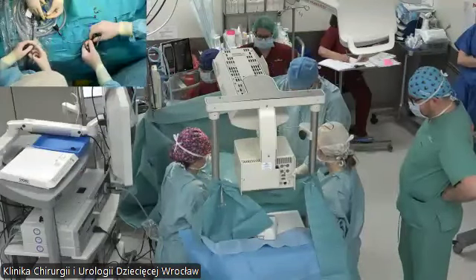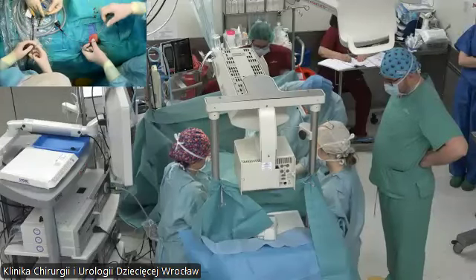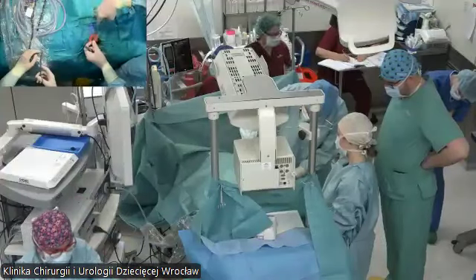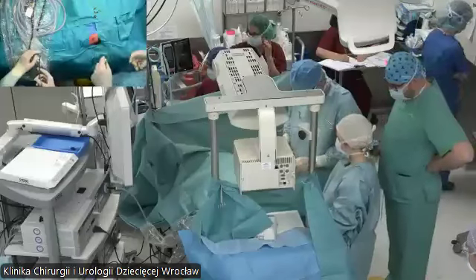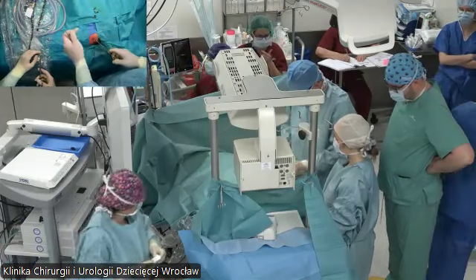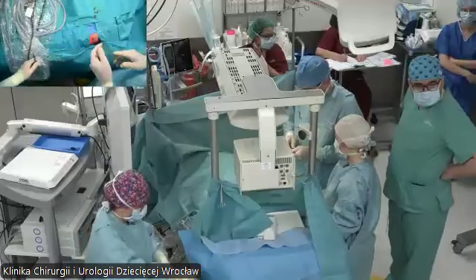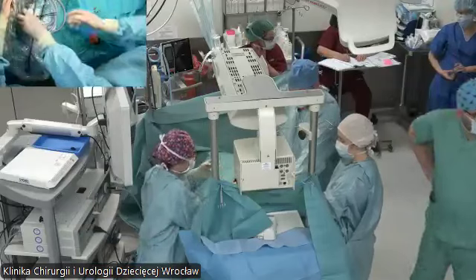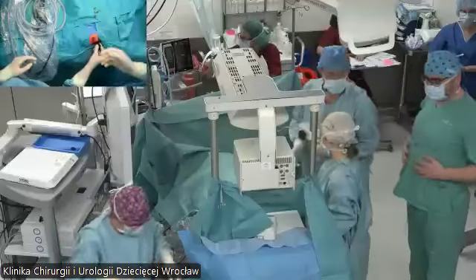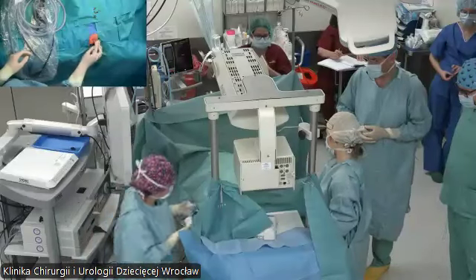Please expand the lungs. Okay, so right now we expand the lungs, we put the drain under the water, there is no bubble, so we take the drain out, and we put our final stitch on it, and that's the end of the procedure. Thank you very much. As you can see, ligation or closure of the fistula with minimal access surgery is really very fast. So just think about it. If you have a baby in not so good condition, you can do the procedure in stages, especially having experience with minimally invasive surgery.